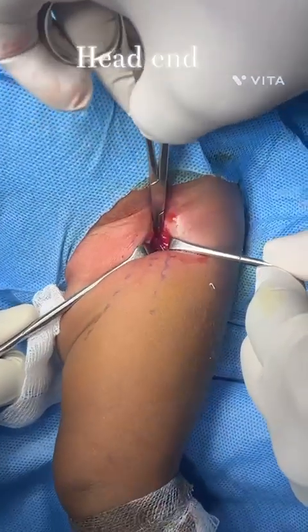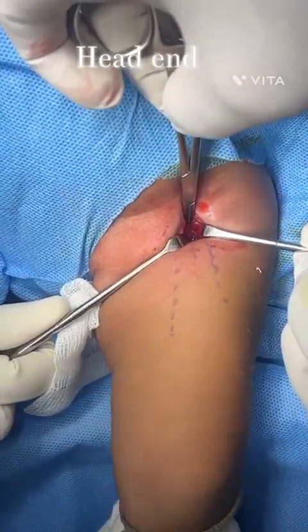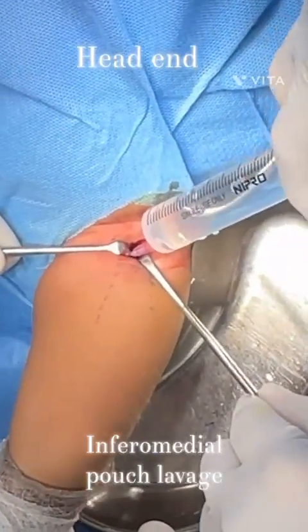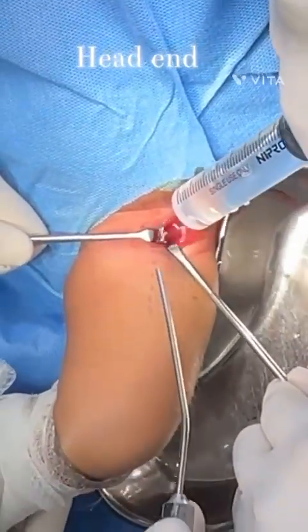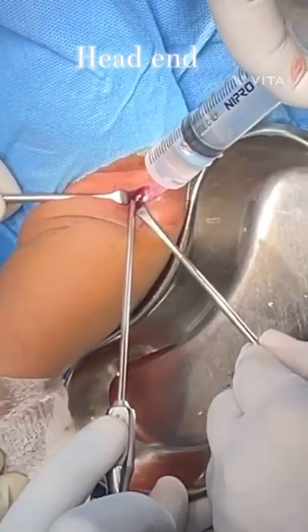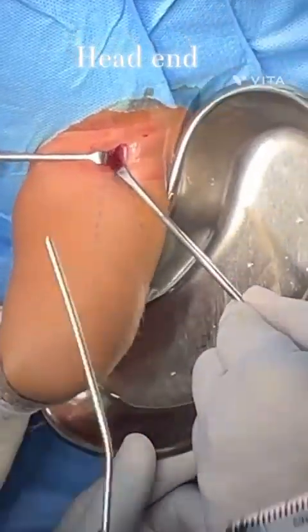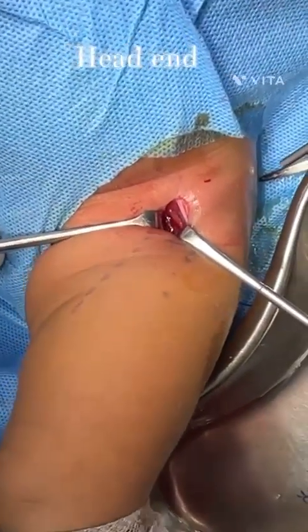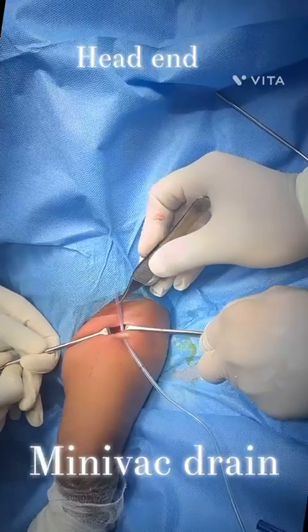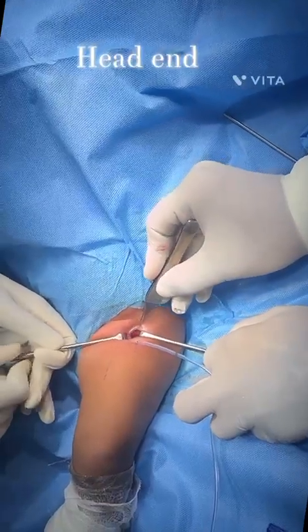Rotate. Start. Suction. Keep rotating. Faster. Put the pointed one in.